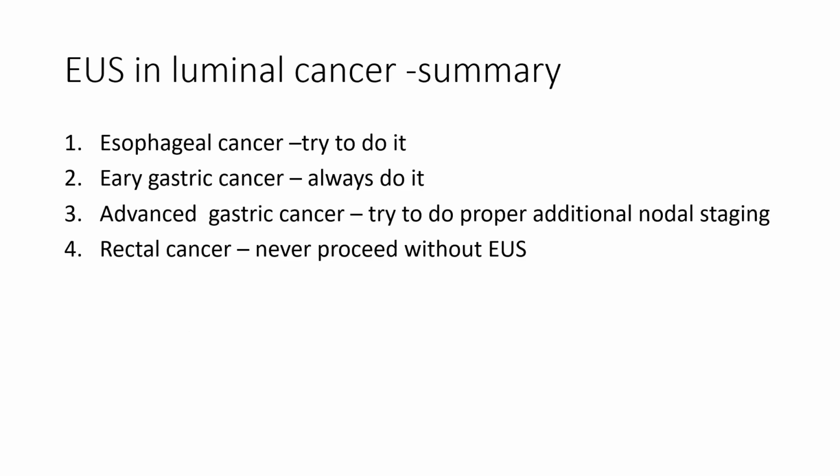So, the summary is, if it is esophageal cancer, try to do it. It is difficult. Early gastric cancer, whatever they say, always do it because you will become wiser. Advanced gastric cancer, try to do it for proper nodal staging. And rectal cancer, never proceed without EUS.